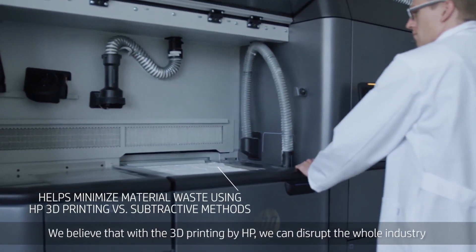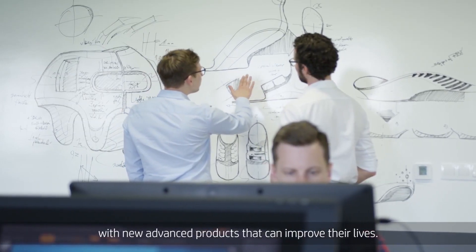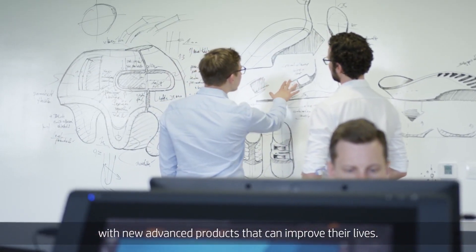We believe that with 3D printing by HP, we can disrupt the whole industry by providing patients all around the globe with new advanced products that can improve their lives.